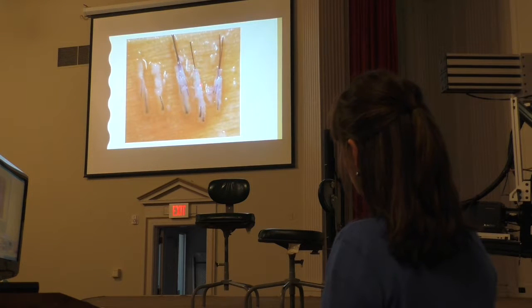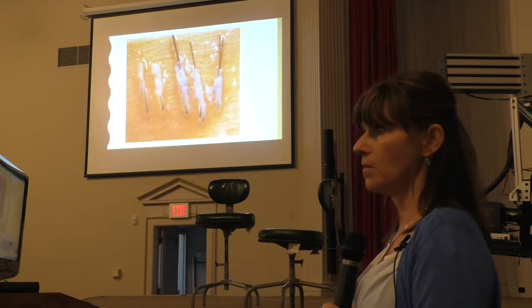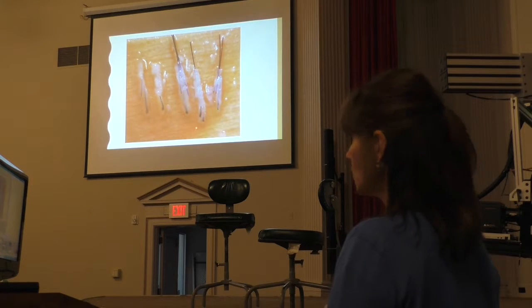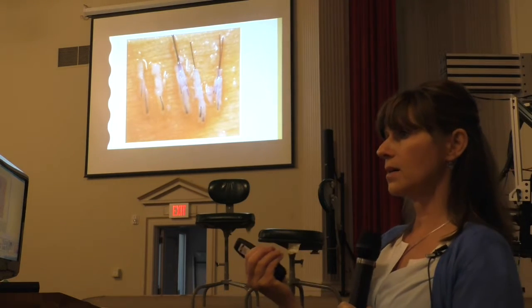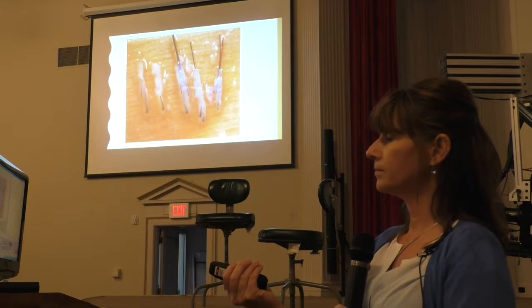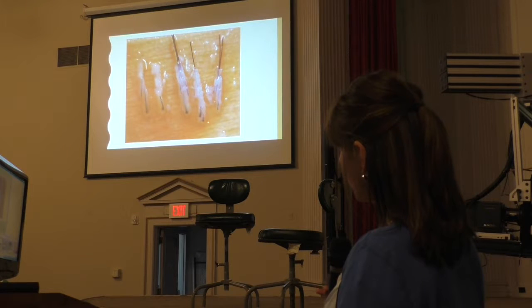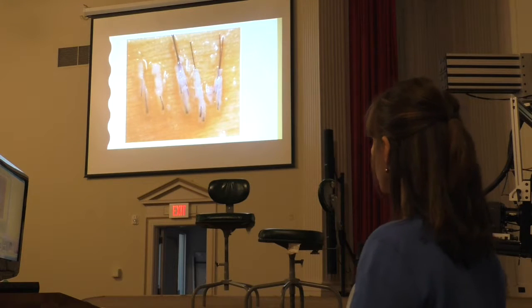This one has a good 1 hair shaft, but how about this one? Would this one survive? Yes? Maybe? No. If I place this one in, since this piece is not firmly attached to the other structures, it could twist and become like a foreign object, so it can cause a pimple, an inclusion cyst. So you want to trim that. The way you trim it, you position your blade and cut away from the good follicular unit so you don't damage that one. Any good ones in this one? No, there's no good ones in that one.